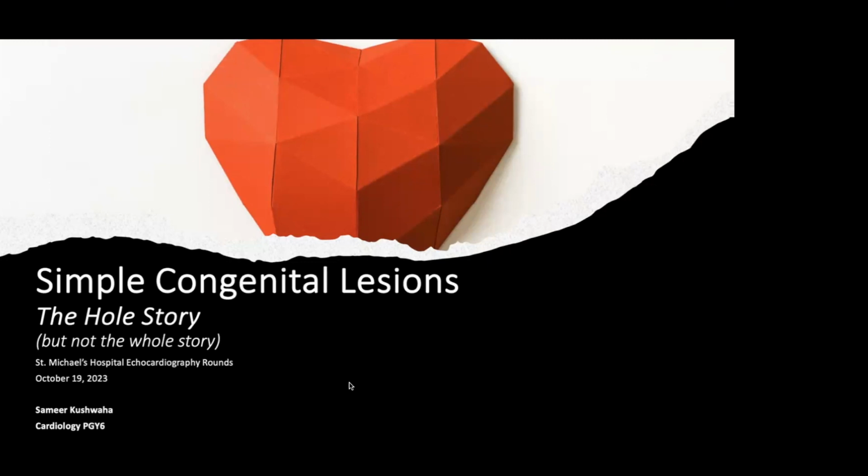I'm one of the C3s in the program, and today I'll be talking about simple congenital lesions, and specifically the story about the ASDs, VSDs, the holes in the heart. But not everything that can be covered about this topic, because it's very difficult to do that justice within an hour. But we'll cover what we can with a focus on the echo findings.